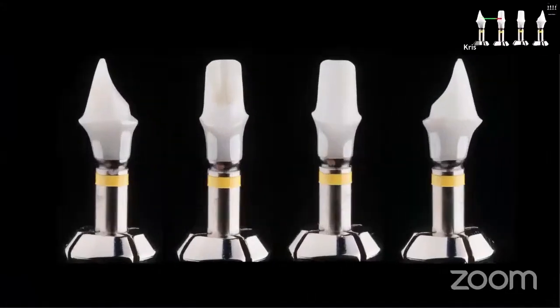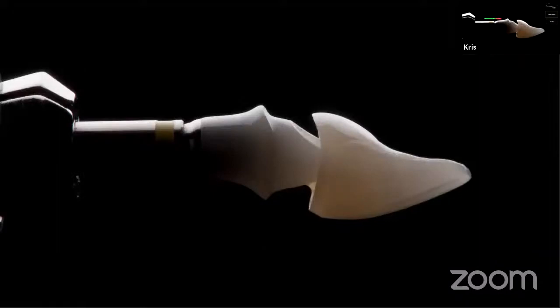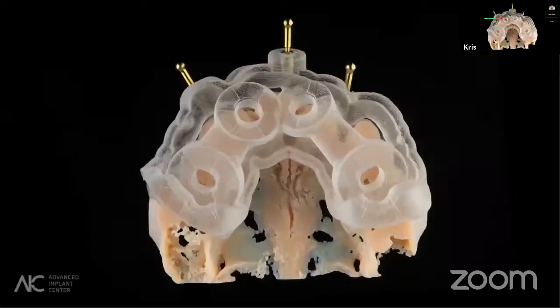Product photography is more related to the lab work, but because I work both in the clinic and in the lab as well, we are using our facility and the materials and tools which we have just to document it in the perfect way, just to deliver enough light, and to deliver pictures which are very clear to understand and very clear to show, because in such cases you can show the specific features of the crown, translucency, transparency, shape of the tooth.